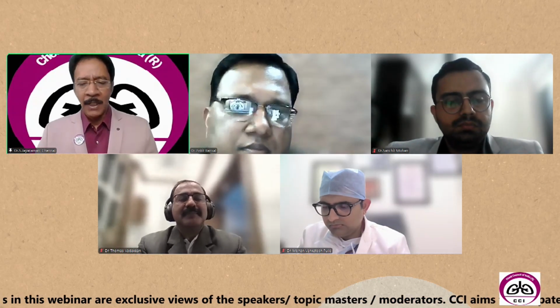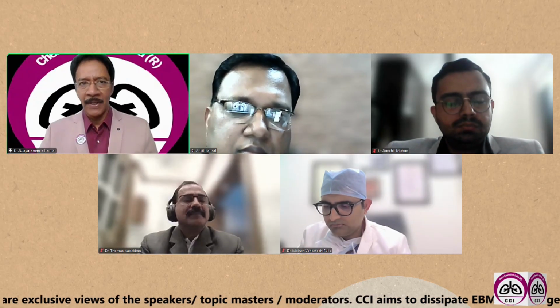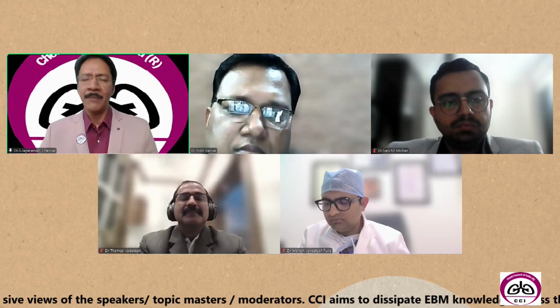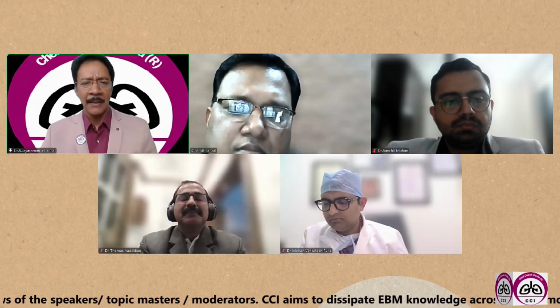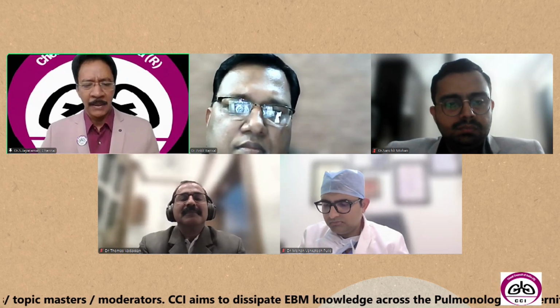Yes. So nowadays we have reached all the other areas like 10, 11 and all with EBUS guidance. But for beginners, subcarinal and right lower paratracheal is the ideal way to start. Thank you, Ankit. Move on to Dr.